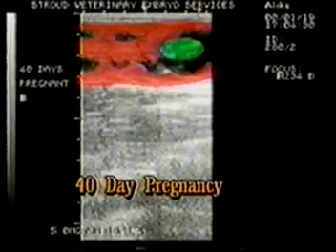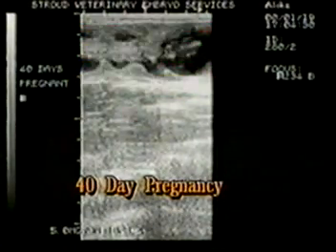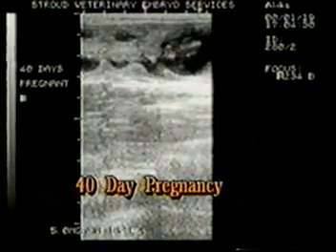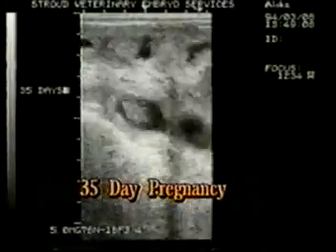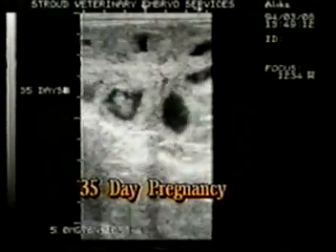The red color is superimposed over the uterus. Green covers the fetus. At 35 days, the fetus is smaller but still has a discernible heartbeat. The volume of pregnancy fluids is obviously lower.